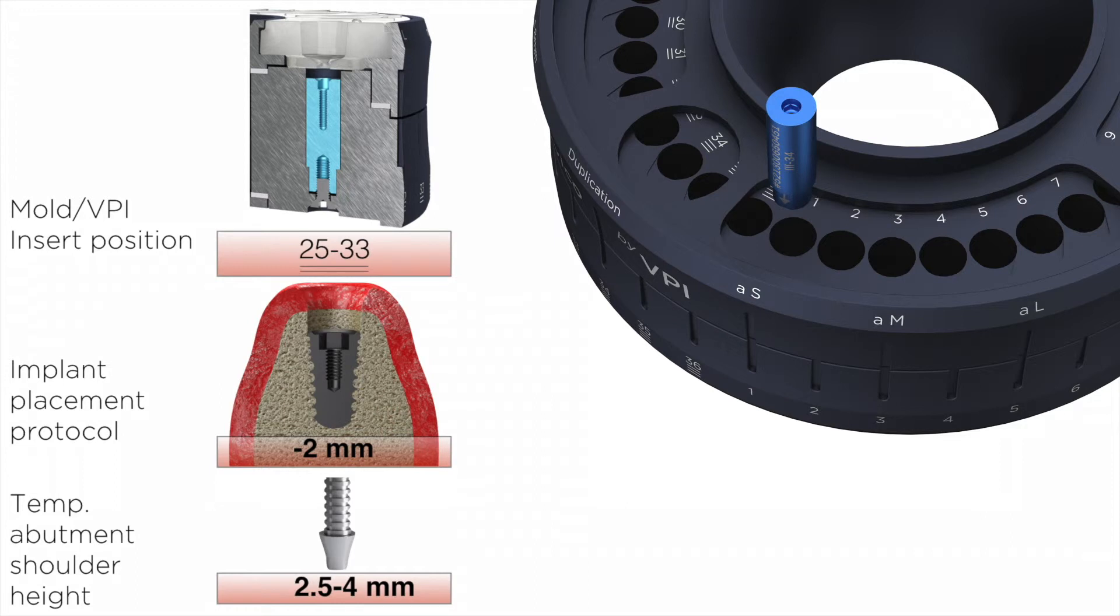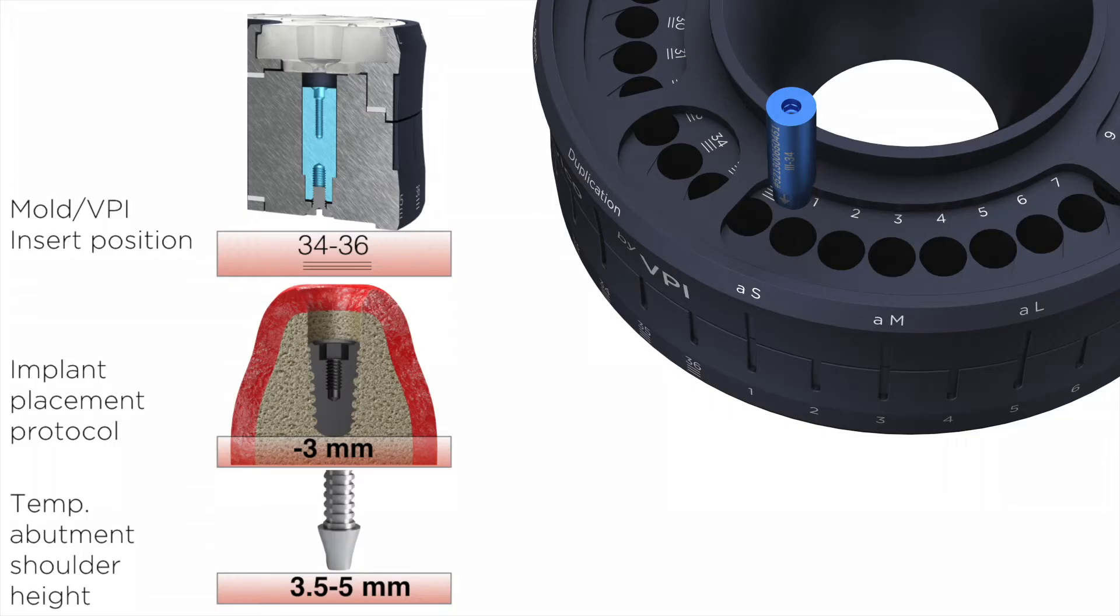Sockets number 29 to 33 can receive the VPI prosthetic connection insert, the last being sunk two millimeters into the socket. This is useful if your implant protocol placement involves two millimeter sub-crestal placement.